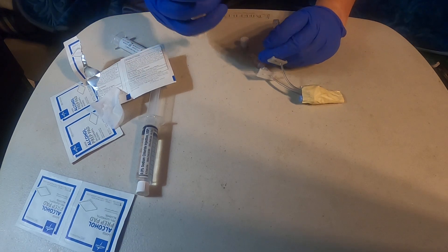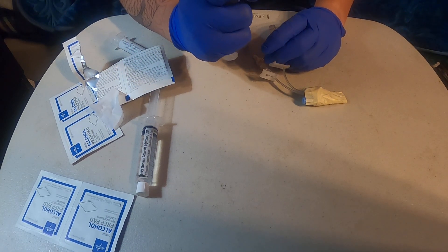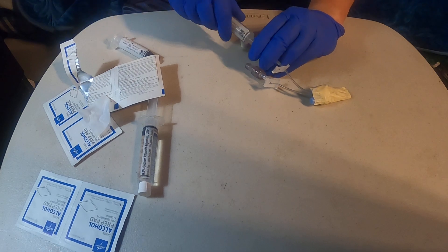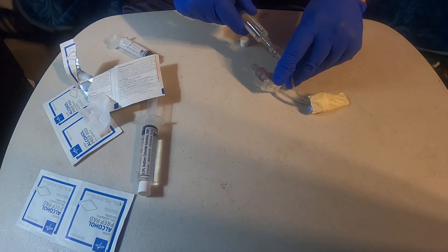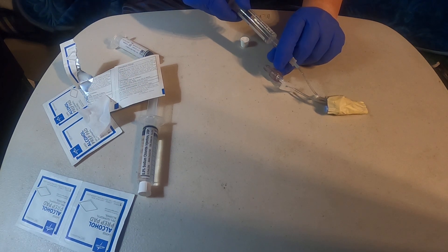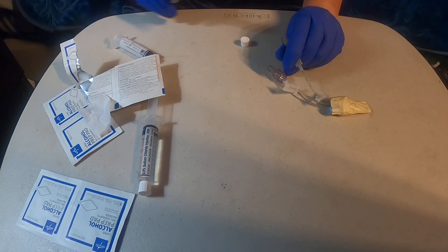Following that, you're going to go ahead and uncap your syringe and take out the air bubble. You would attach it, unclamp it, and then you would flush. After you flush the whole 10cc syringe, you would unclamp this.